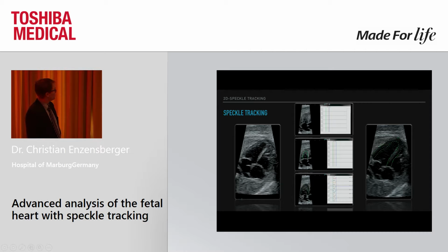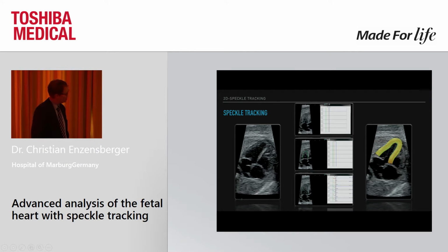And finally, as you can see here on the bottom, the ROI is divided into 6 segments, which can be shown later on a slide. You have a basal part, a middle part, and an apical part, and then for each the lateral free wall and the septal wall.